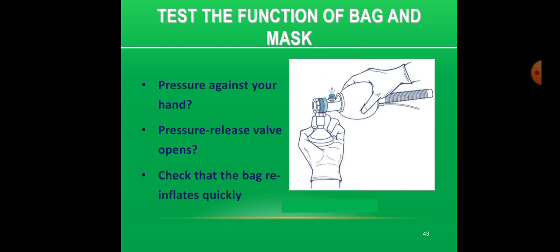Test the function of the bag and mask for ventilation. Fit the mask onto the bag and deliver test breaths against the palm of the hand — you should feel pressure in the palm when the bag is squeezed. Form a seal between the mask and the palm of the hand. Squeeze the bag enough for the pop-off pressure relief valve to open and make a sound as the air escapes, as shown in the picture. Check that the bag re-inflates quickly when you release after squeezing.